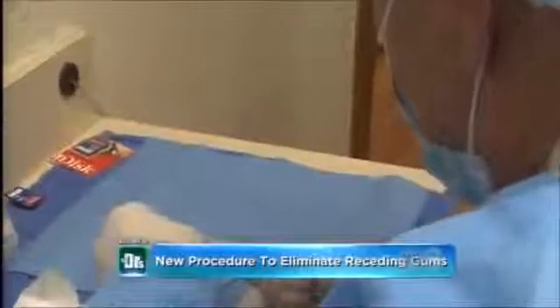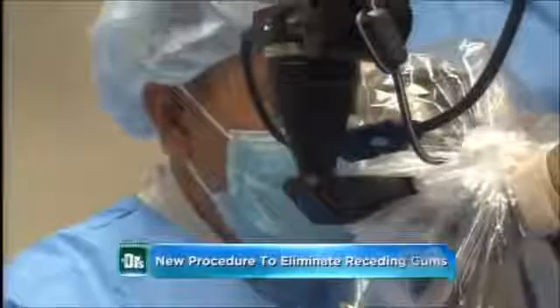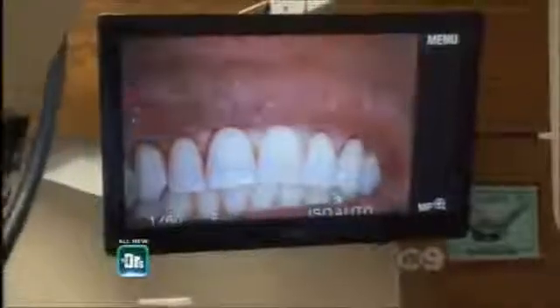Now we're ready to put the collagen strips in between the teeth, and then we'll be done. The collagen strips will keep the gums from going back up. Now the gums are right where they belong. We did it in 57 minutes. We did 10 teeth. Looking really nice. It'll be a total change.